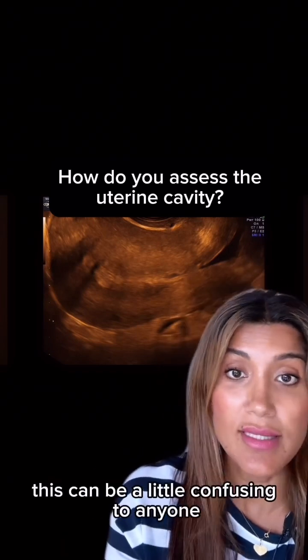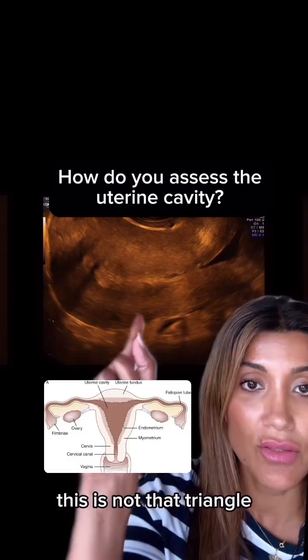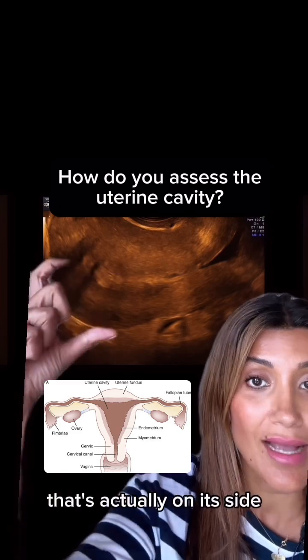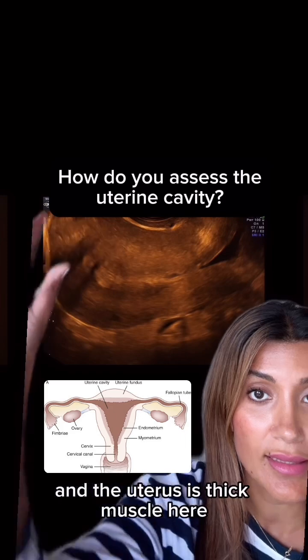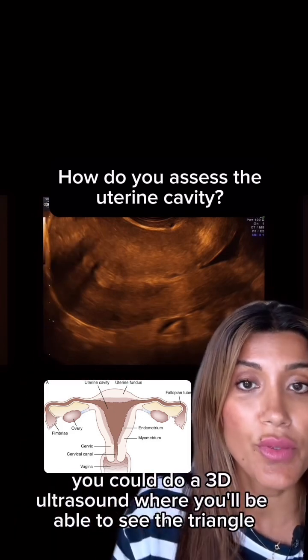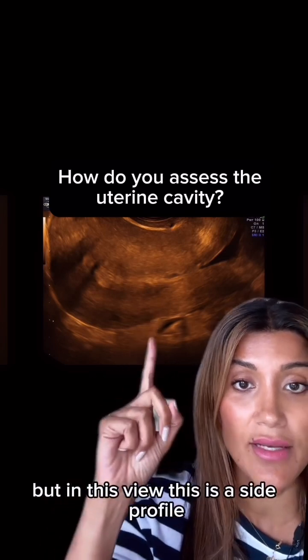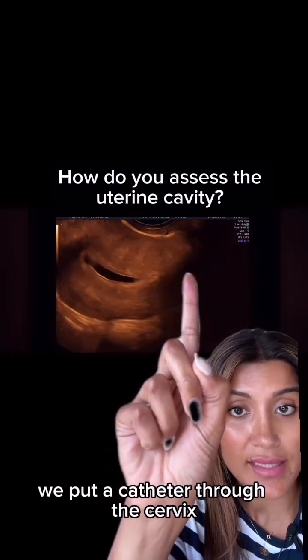This can be a little confusing to anyone who doesn't regularly look at ultrasound images. This is not that triangle-shaped uterus that people are used to seeing in a textbook. That's actually on its side, and this is the bottom, and this is the top of the cavity, and the uterus is this thick muscle here. So we're essentially getting a side profile view. You could do a 3D ultrasound where you'll be able to see the triangle, but in this view, this is a side profile.